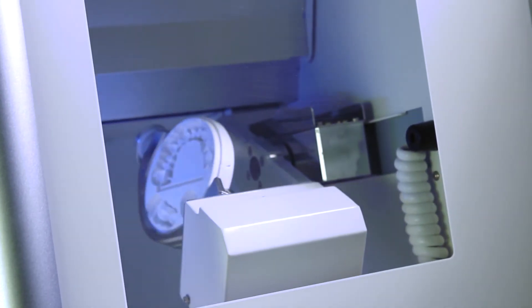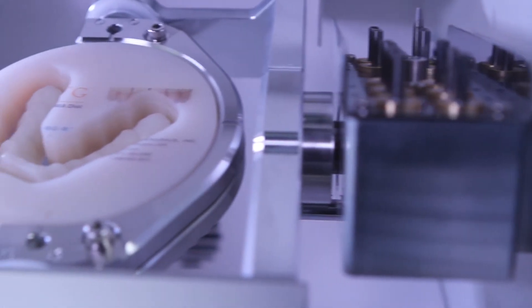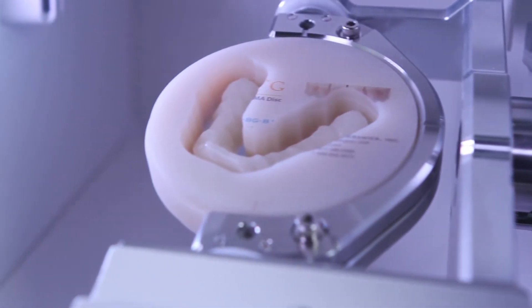Built to last, the DWX51D provides ease of use, reliability, and quality for the most demanding of labs or those just getting into digital milling.